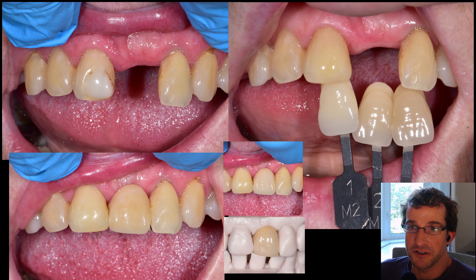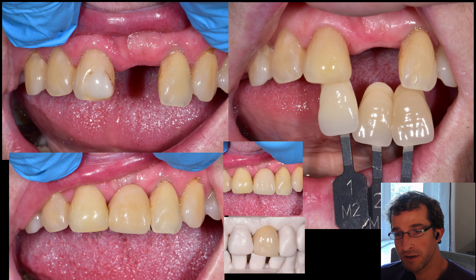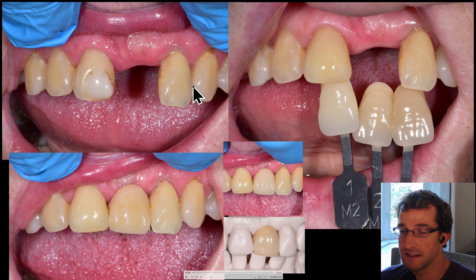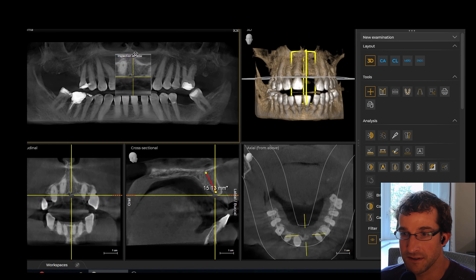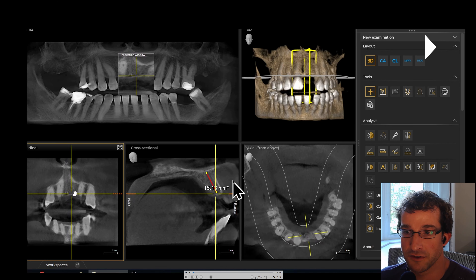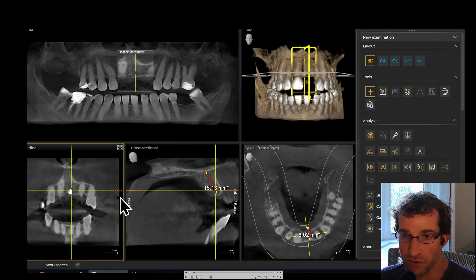Hey guys, Dr. Dobson. We're going to do a Maryland bridge case in this video. This is a patient who came to me from out of town for an implant consult. We took a CT scan and here are the results — you can see there is clearly enough bone to do an implant. We have about 15 millimeters of vertical bone and about seven millimeters or so of horizontal bone.